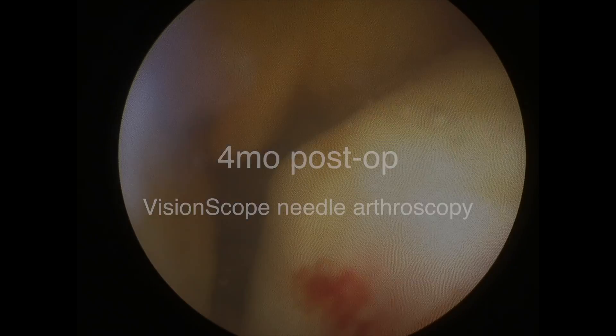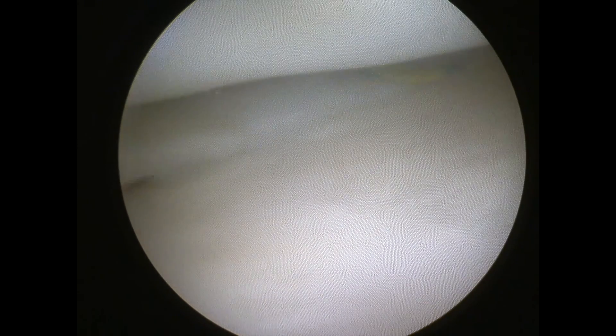At four months post-op, I did a second-look scope, starting in the notch where the meniscus used to be, and swung down into the joint and flushed the meniscus with saline through the scope. Granted, this isn't as good as a probe, but it does give us a sense for how the tissue is behaving. Also notice, I dragged a little fat down with one of my knots — and when that happens, I usually just say stem cells.